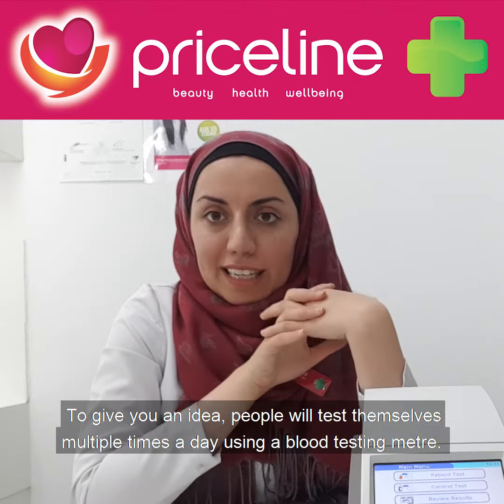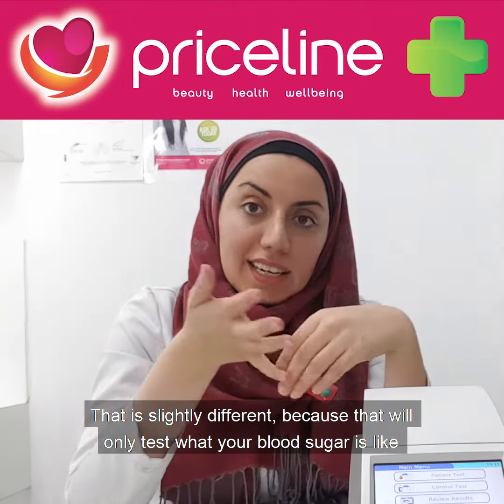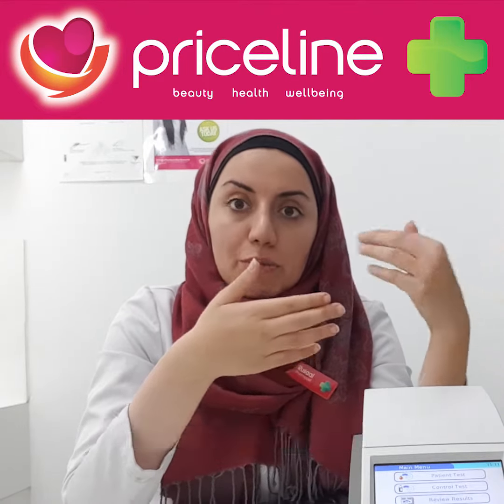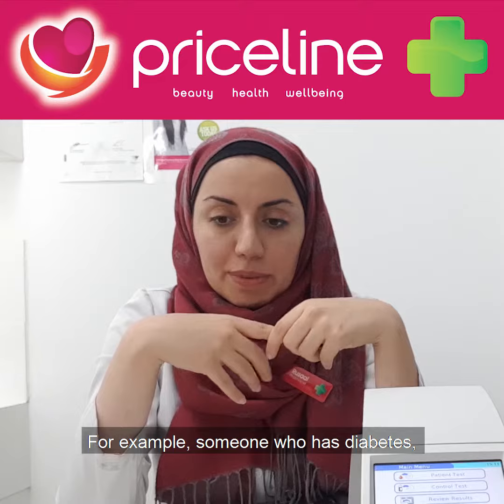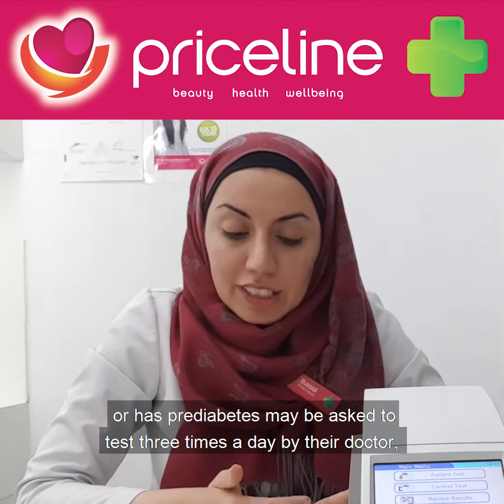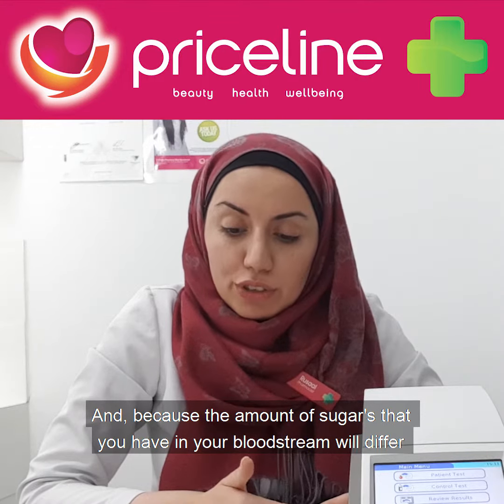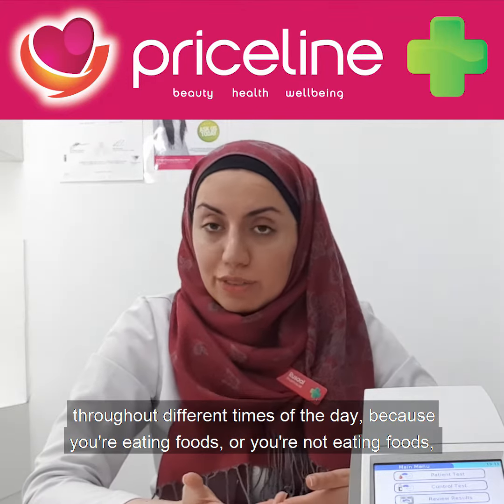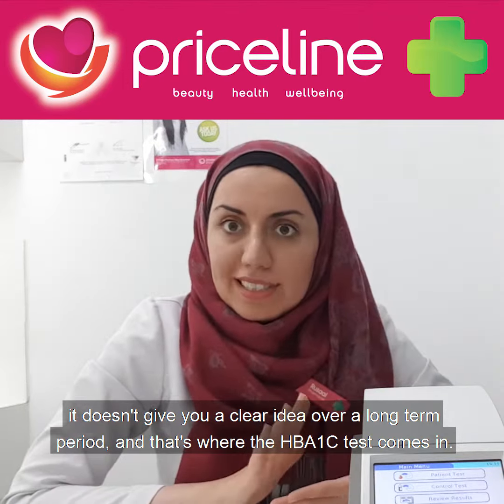So to give you an idea, people will test themselves multiple times a day using a blood testing meter. That is slightly different because that will only test what your blood sugar is like in that current moment in time, which is why patients need to test multiple times in a day to see what their blood sugar is like. So for example, someone who has diabetes or has pre-diabetes may be asked to test 3 times a day by their doctor using a blood glucose testing meter. And because the amount of sugar that you have in your bloodstream will differ throughout different times of the day, because you're eating foods or you're not eating foods, it doesn't give you a clear idea over a long-term period. And that's where the HbA1c test comes in.